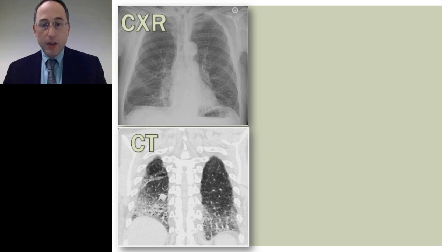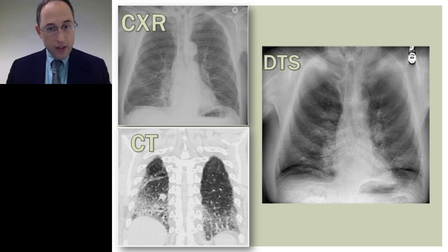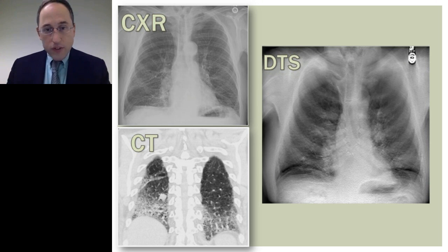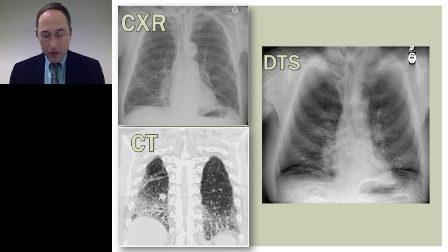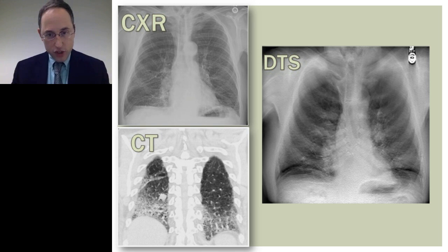All right. Now I'm going to show you a tomosynthesis image. It is somewhere in between that radiography image and the CT image. If you look, notice how you don't see all of the anatomy that you see in the upper left-hand corner. You're only seeing things that are in the slice that you're focused at. You get a stack of images, and as you scroll through the person, there is something called the plane of focus. It is like the level that you scrolled through on a CT. Anatomy in a tomosynthesis image that is in the plane of focus is sharp. As things move out, they become blurry.